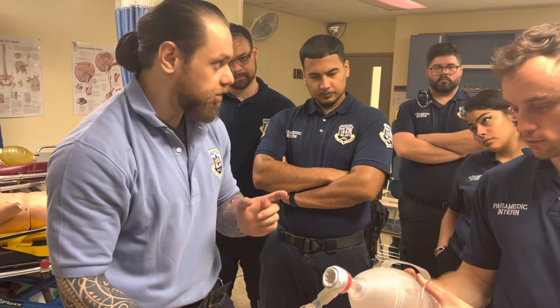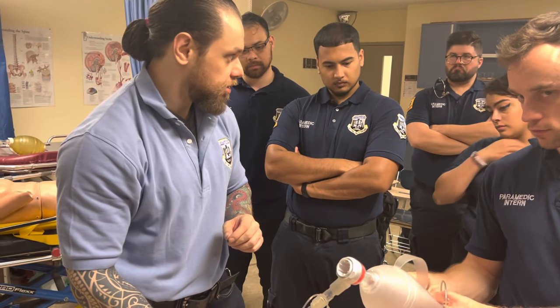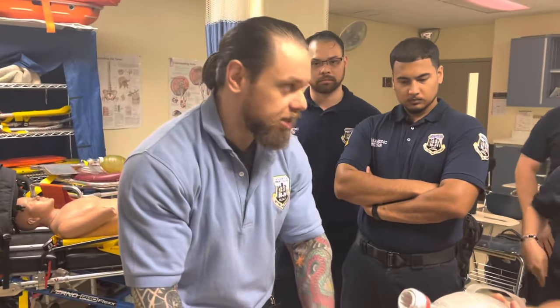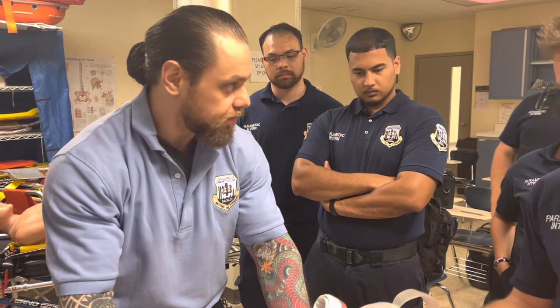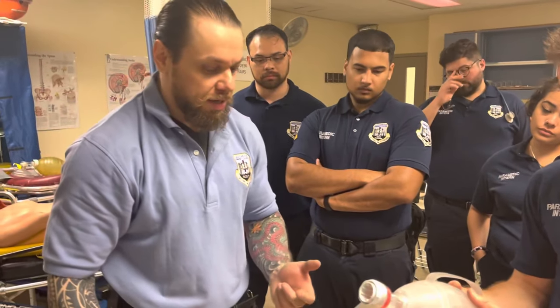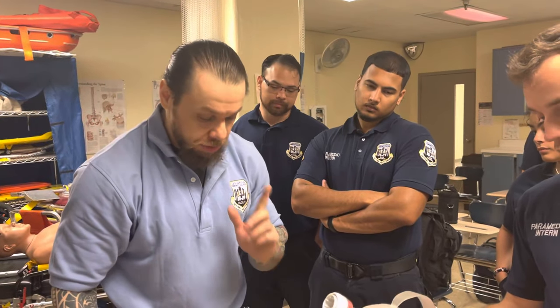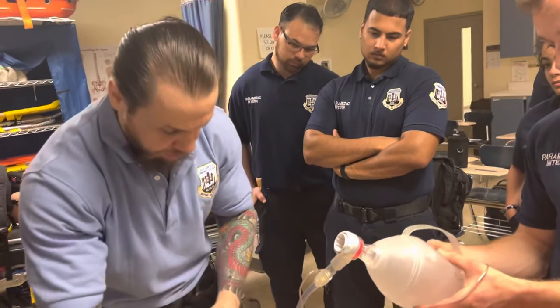James's job - holding the earmuff technique - he doesn't let go until the collar is back on. I kind of did the procedure quite fast, but I just want to show you something: if we needed to pre-oxygenate the patient and we started already intubating, this is going to be quite difficult to do.